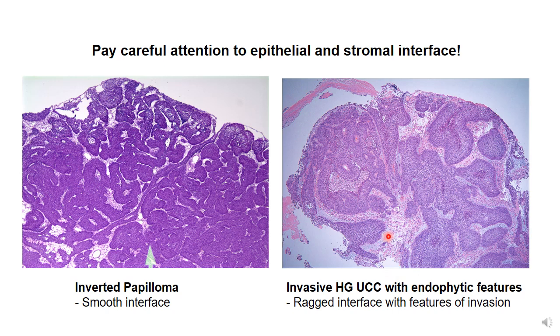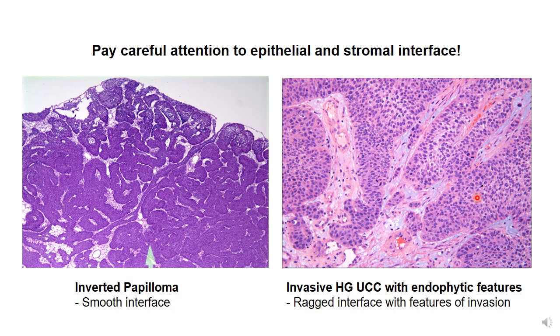You can also see that the stroma looks pretty reactive, and when you look at high power, you can see that there are small irregular infiltrating nests with myxoid stroma, jigsaw kind of haphazard growth. So these are the features that would help you to distinguish an invasion from a so-called endophytic process, which itself can confuse you with invasion.